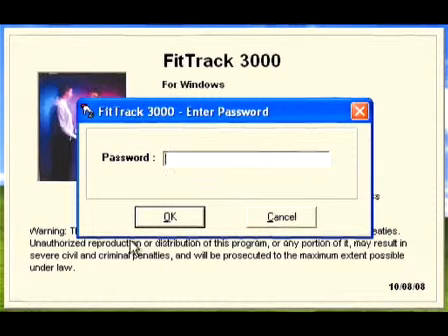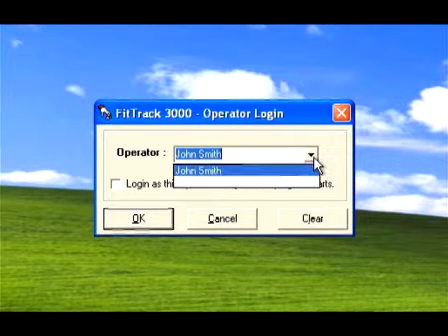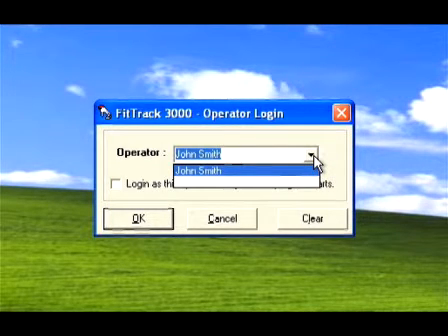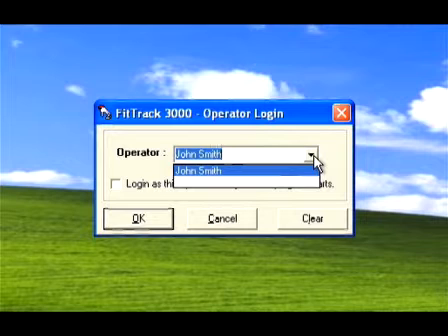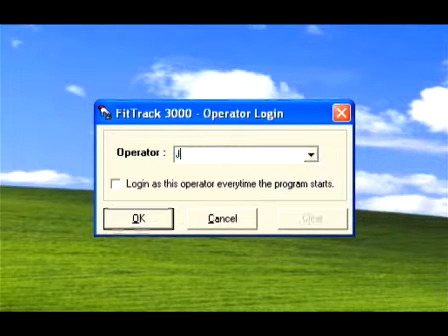Then you will see the operator login window. The program defaults to the user who last logged into FitTrack. You can choose the user displayed by clicking OK, or look for a name on the drop-down list. If the name does not appear, simply type in a user name.